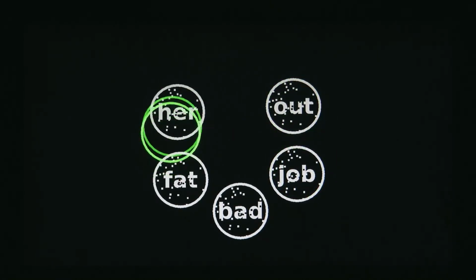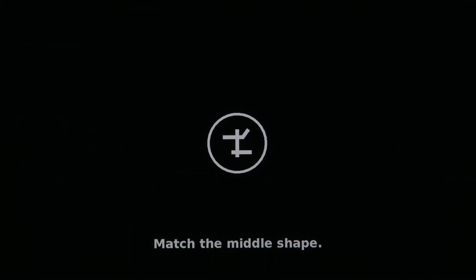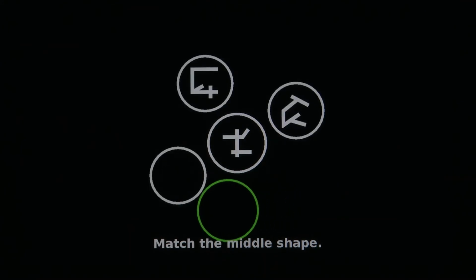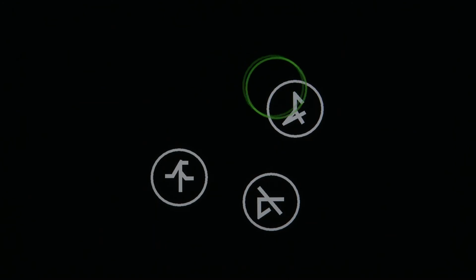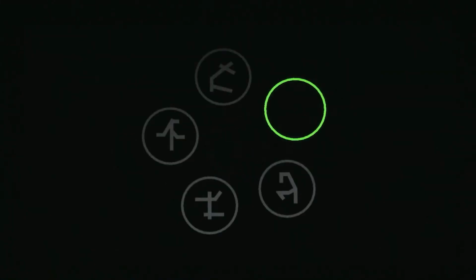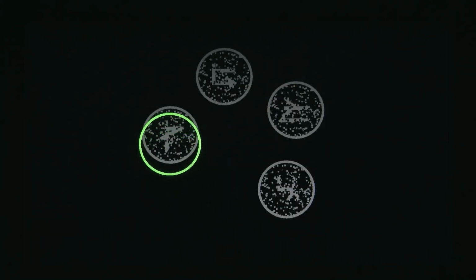The word perception and memory tests incorporate the 30 most common 3-letter words. The next is shape memory, which measures the patient's ability to remember non-verbally mediated shapes that are unique to Cognivue. The memory tests incorporate immediate recall, attention, working memory, and simulated delayed recall with backward masking. The final test is motion memory.